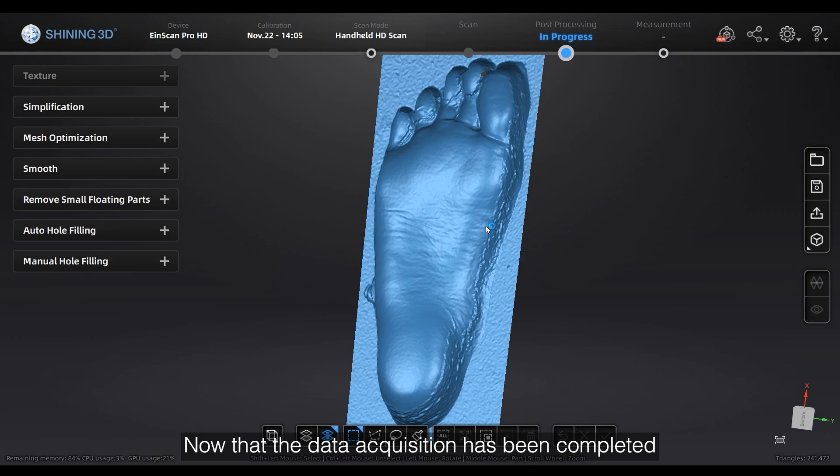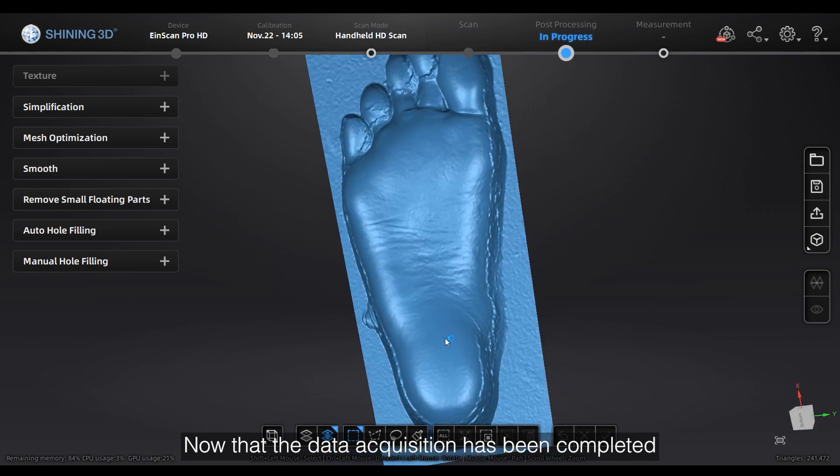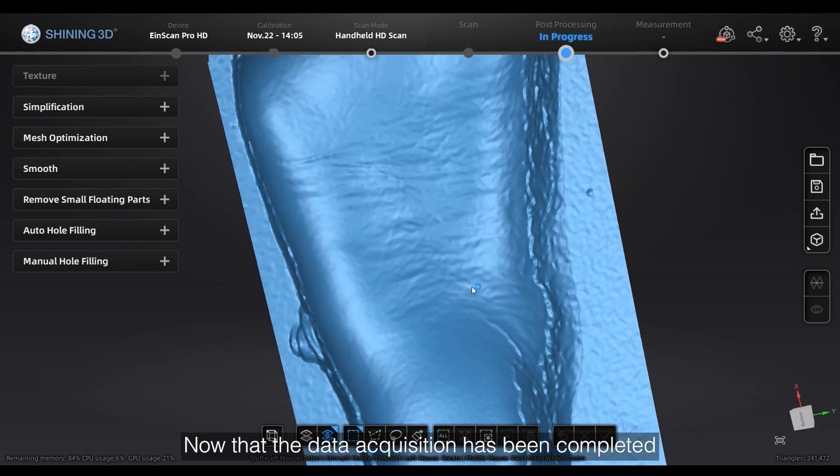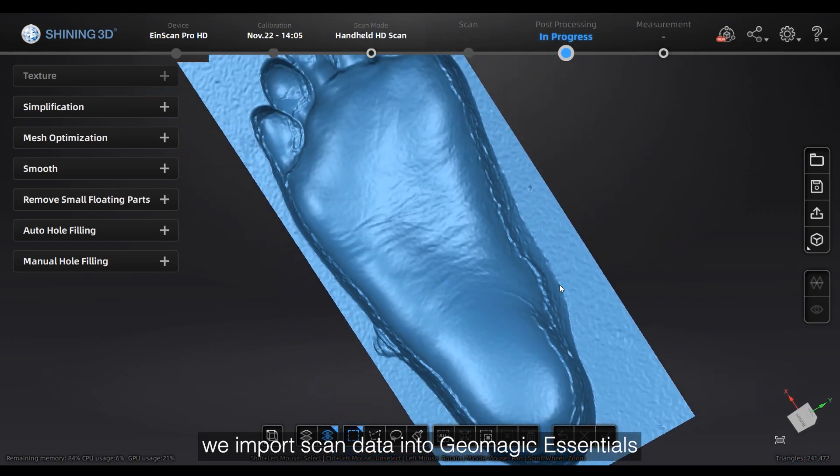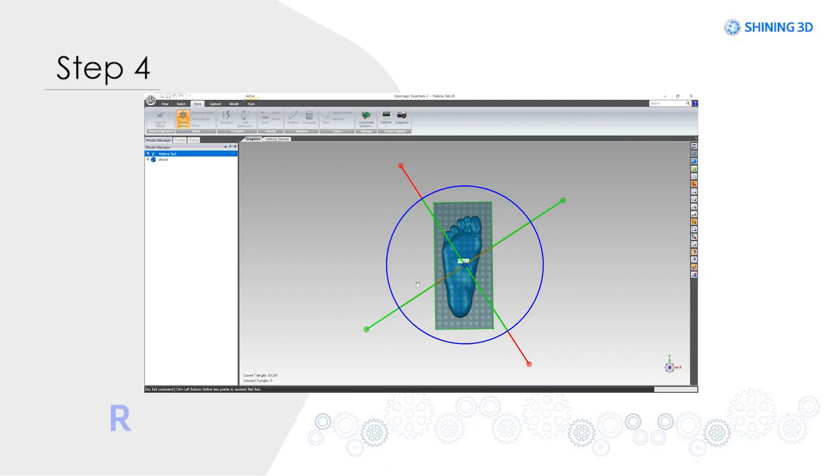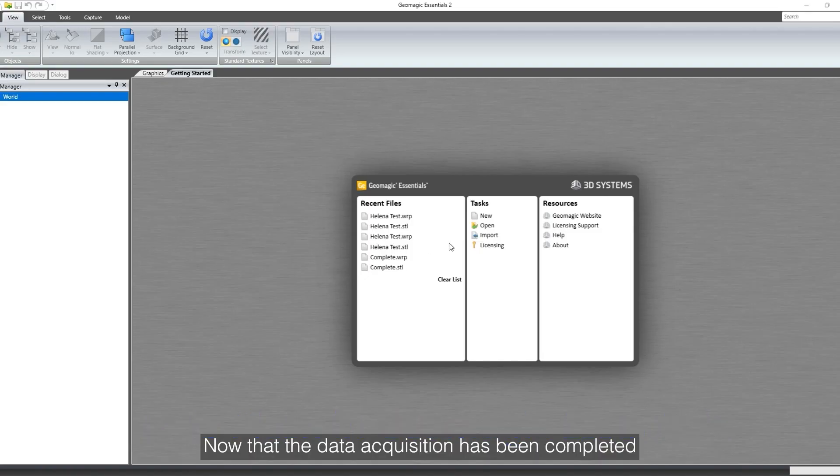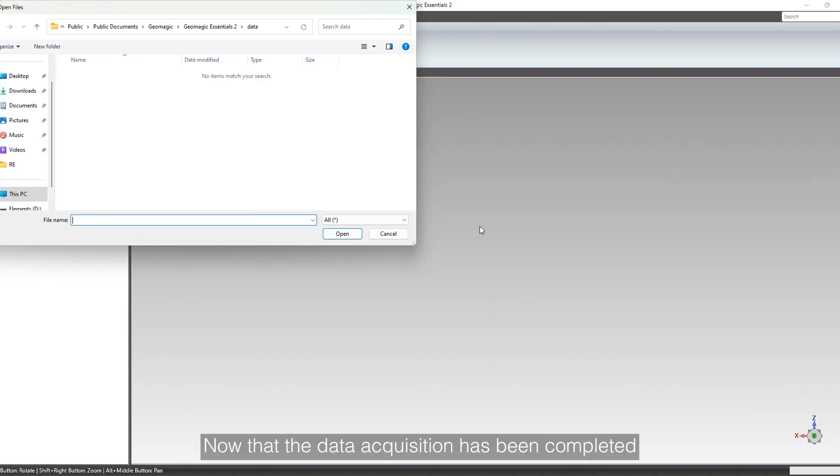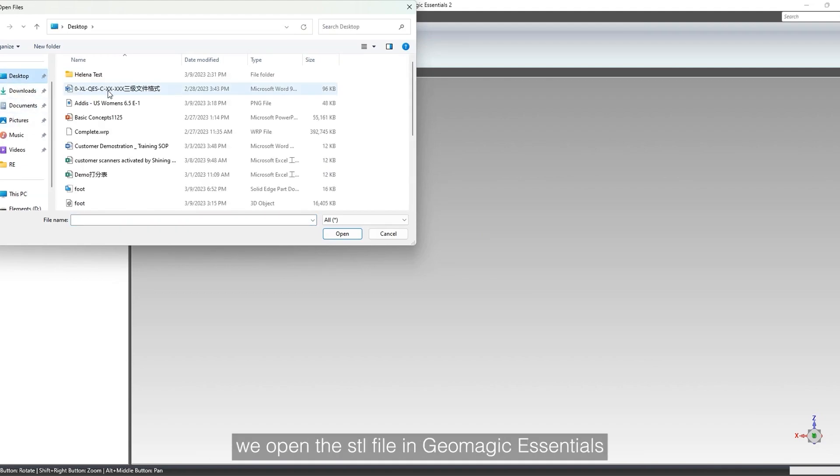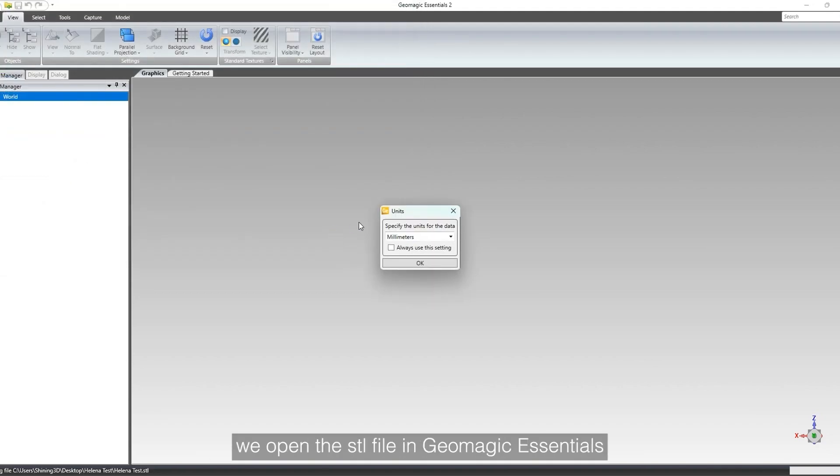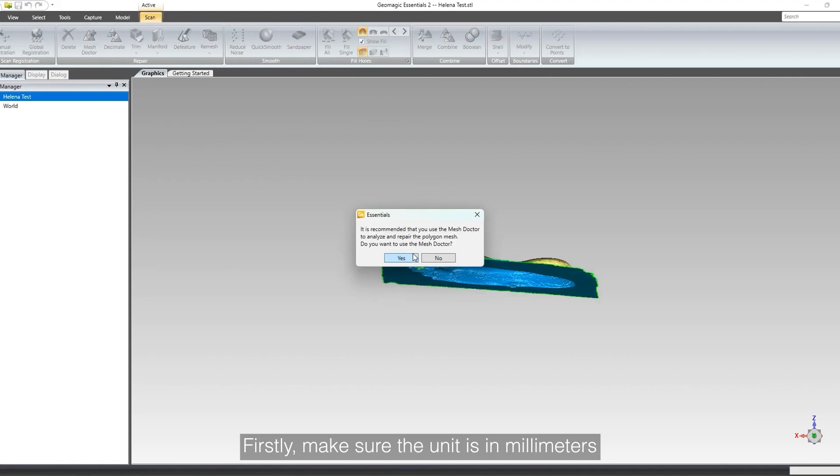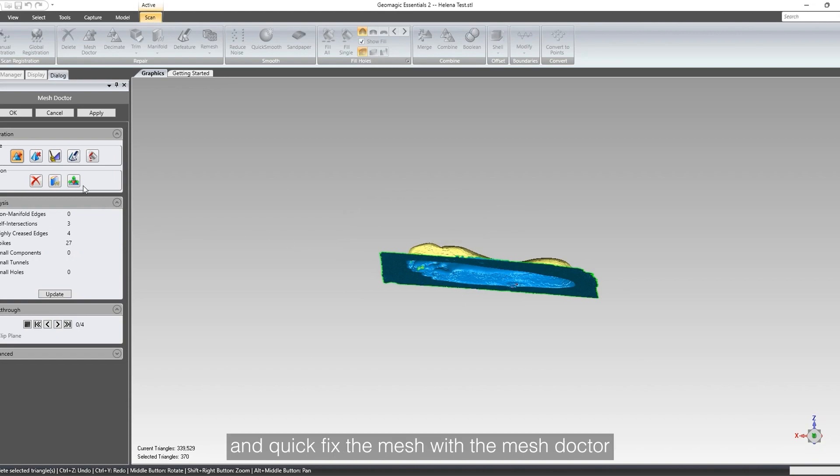Now that the data acquisition has been completed, we open the STL file in Geomagic Essentials. First, make sure the unit is in millimeters, and quick fix the mesh with the mesh doctor.